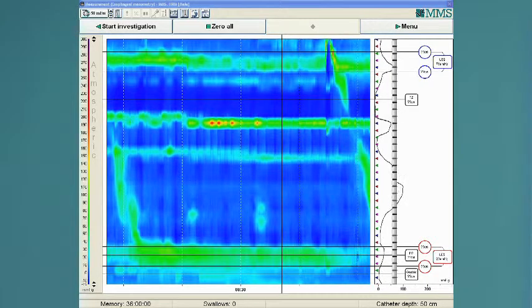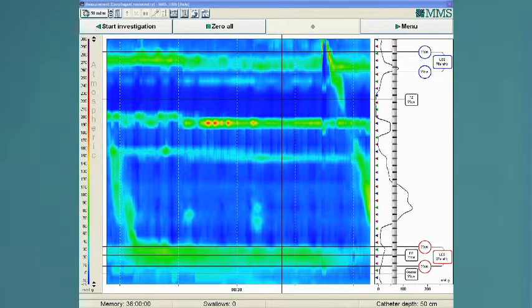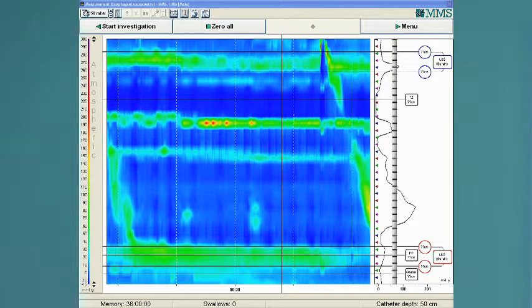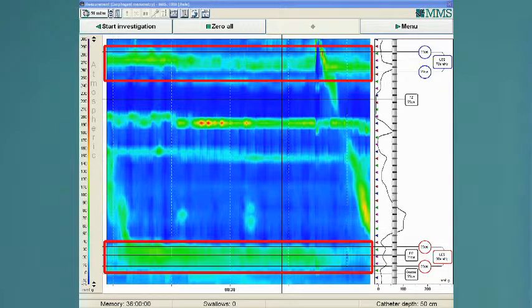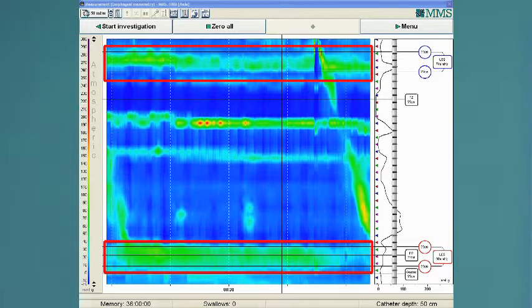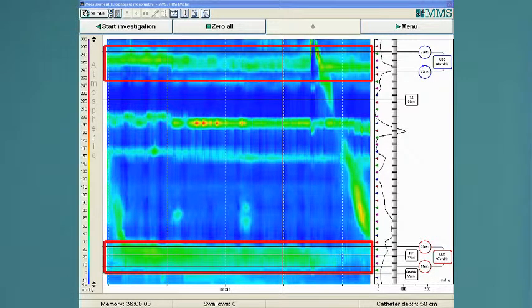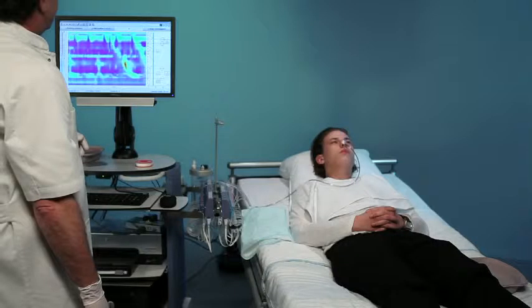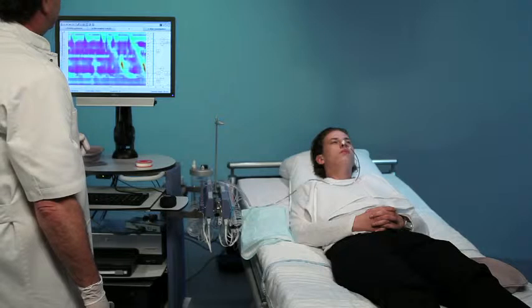Position the catheter. Verify the landmarks of the upper and lower sphincter on the screen. Ask the patient to take a deep breath to control the position of the catheter.